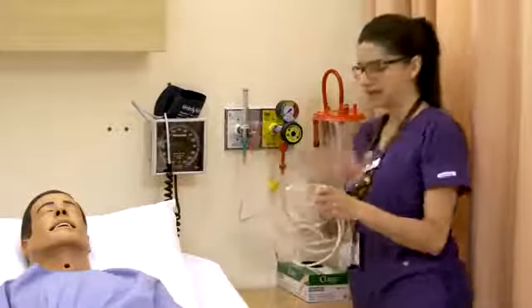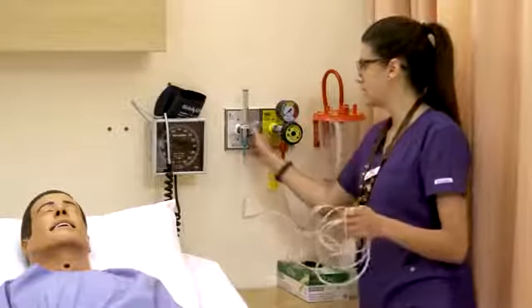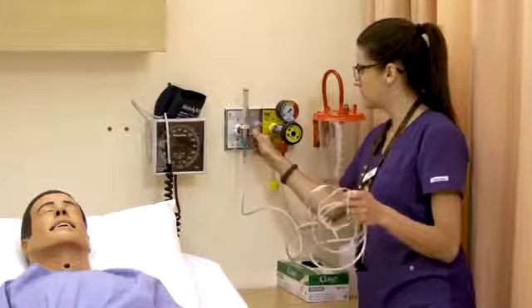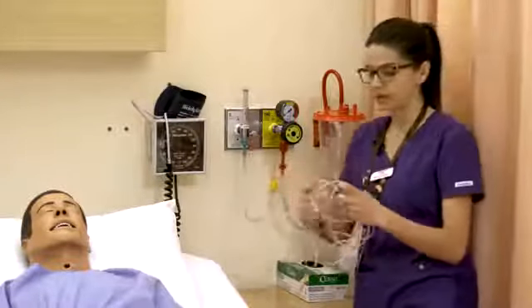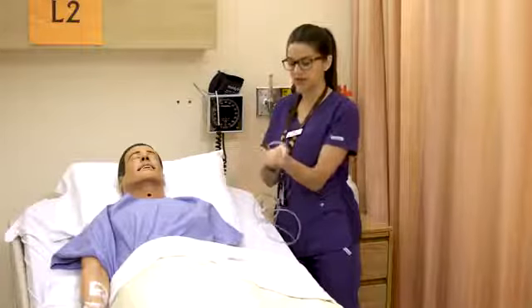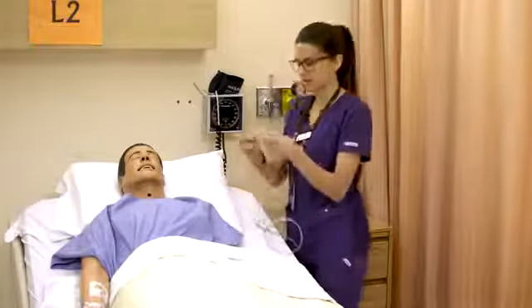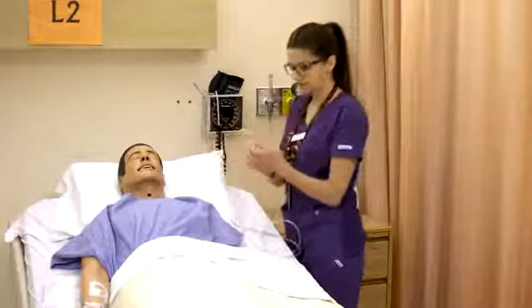So I said we have a range with the nasal prongs of 1 to 6 liters. So maybe we'll choose 3, just somewhere in the middle. So we'll turn them on to 3, and it's not as drastic all the time hearing it. You don't want to touch this because it's going to go on the person's face, but you can usually feel it lightly blowing somewhere on your hand or your wrist, somewhere with sensitive skin and those fine hairs. And now we're going to attach it to our patient.